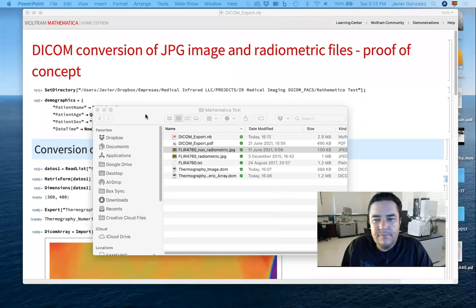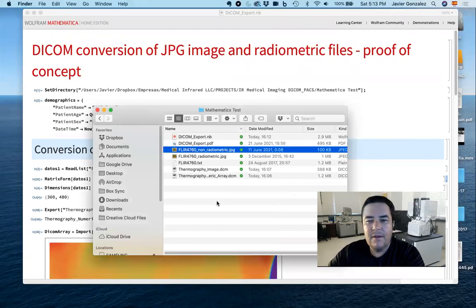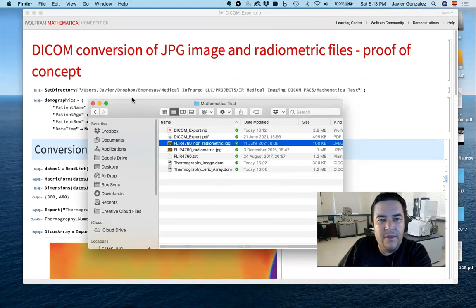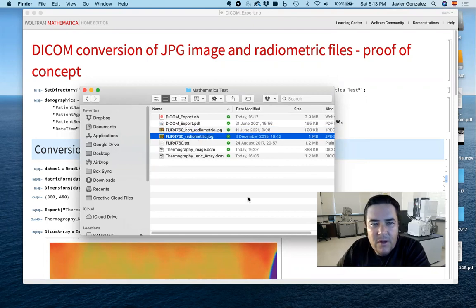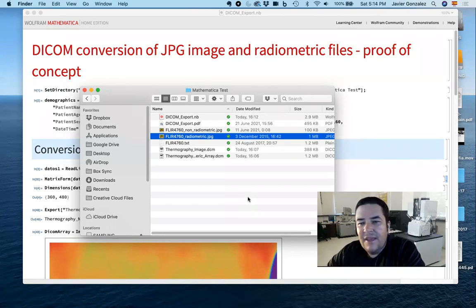Here, I have a folder with several files. Here you can see this one, FLIR 4760, which is basically the name of the file that comes right out of the FLIR imaging system. That has radiometric information, and you can see how the size of that file is 1 megabyte, right?